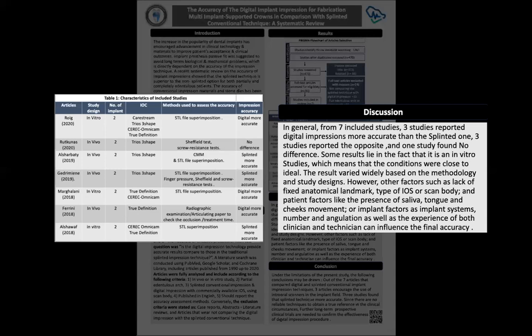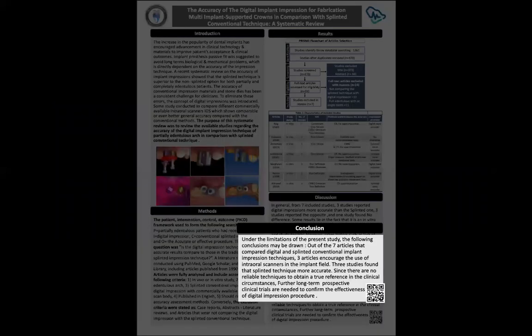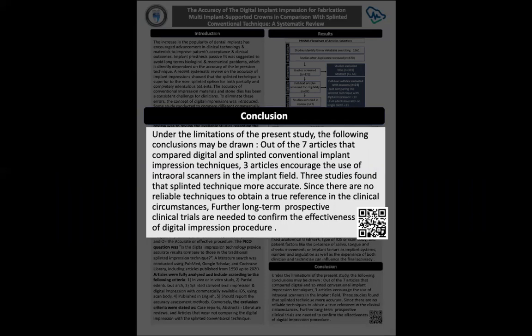And finally, the conclusion, under the limitations of the present study, is that out of the 7 articles that compare digital and splinted conventional implant impression techniques, 3 articles encourage the use of intraoral scanners in the implant field, and 1 study found no difference. Since there are no reliable techniques to obtain a true reference in clinical circumstances, further long-term prospective clinical trials are needed to confirm the effectiveness of digital impression procedures.